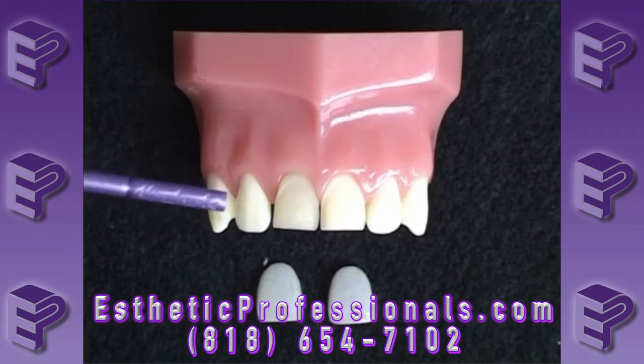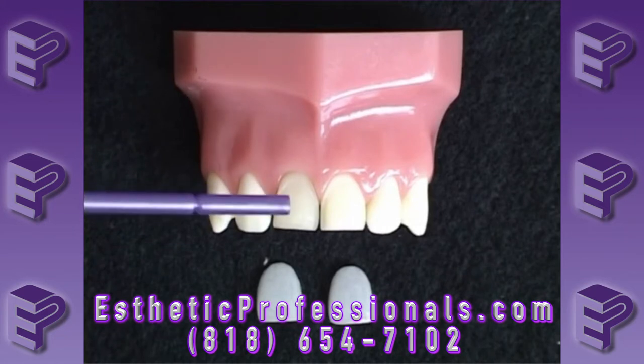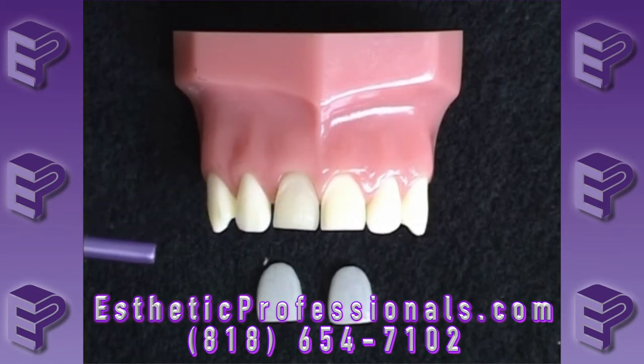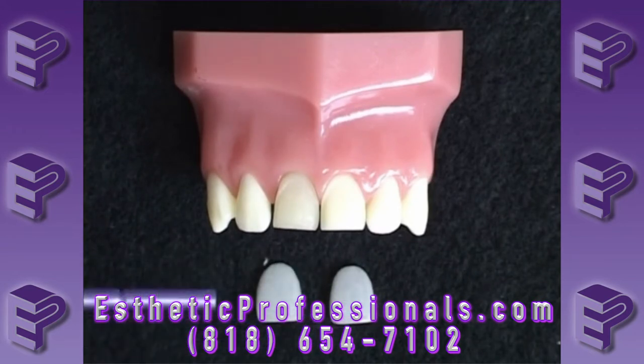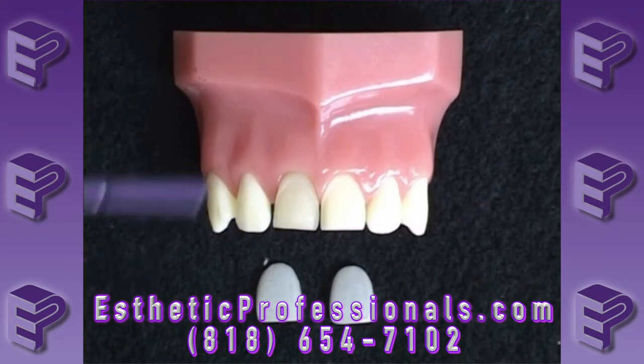For this exercise, we need our anterior sextant model. Number 8 and number 9 have been prepared for some veneers, and you'll notice that number 8 is significantly discolored. We also have two veneers, and they're fairly translucent. This will allow the color to come through. We like to use translucent veneers to let the color of the natural tooth come through, but obviously it'll also let the color of our discolored tooth come through. And this is what we're going to show you how to do today — how to block that discolored tooth out.